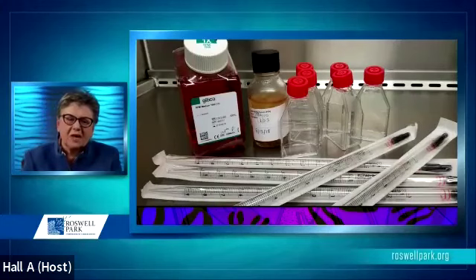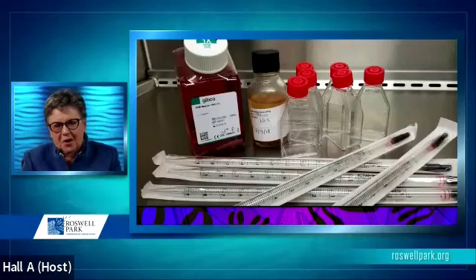You may not be aware of that, but this tissue culture medium was used to grow multiple types of cells in the early 60s here at Roswell Park. Serum supplementation is often very important in tissue culture, and we use up to 17% serum in our culture media. Once the material is harvested, the fixation takes place, usually in a chemical fume hood to avoid exposing people in the laboratory.